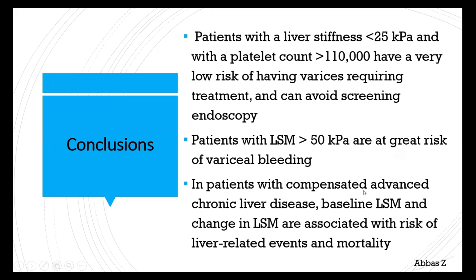In patients with compensated advanced chronic liver disease, baseline liver stiffness measurement is important, and also we should follow up these patients with transient elastography to see any further deterioration in the liver stiffness so that we can predict any risk of variceal bleeding in future, or decompensation in future, and mortality.